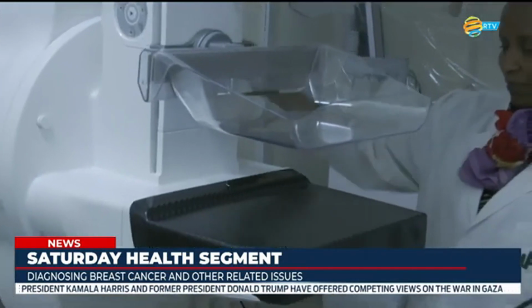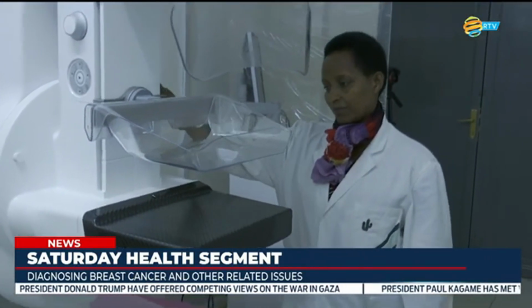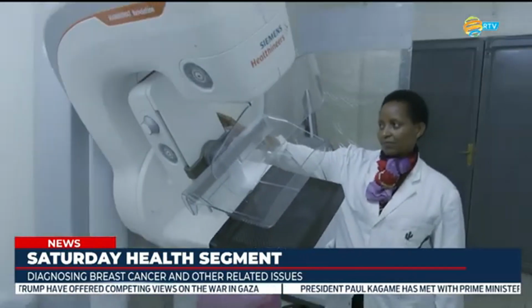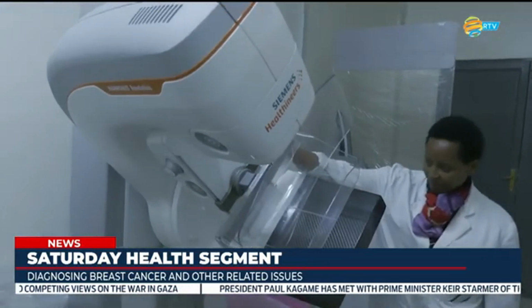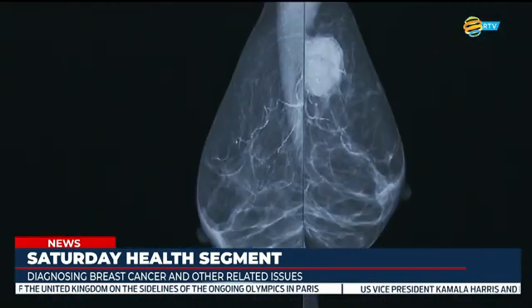If it is benign, then there is some region like, we say, a cyst, a cystic region. Those are regions which contain water-like fluid. With those regions, there is no need to do a biopsy because we are sure, with a confidence level of more than 95%, that it is not cancer. So the patient can stay with that region. If it's small and it causes pain, then it can be removed. If it doesn't cause any other problem, then stay with it. So this machine helps you to categorize so that you can take a decision. Either the patient can go home, or be treated differently from biopsy, or be a candidate for biopsy.